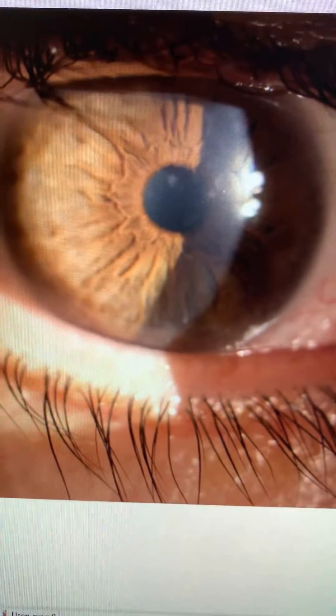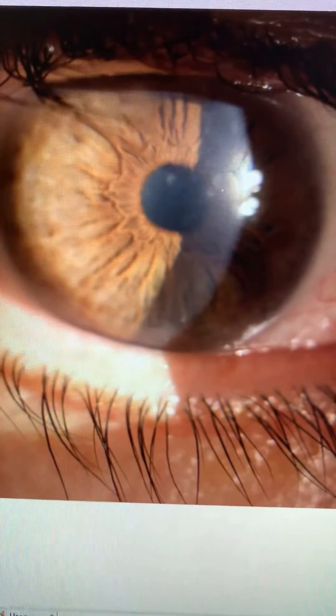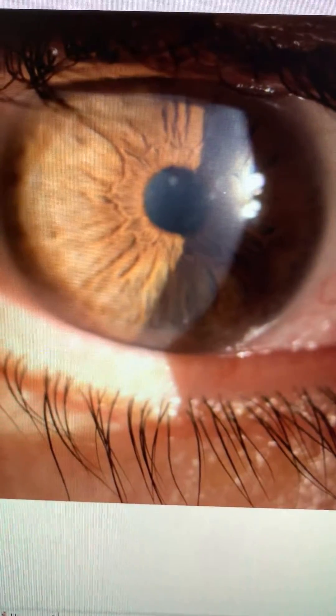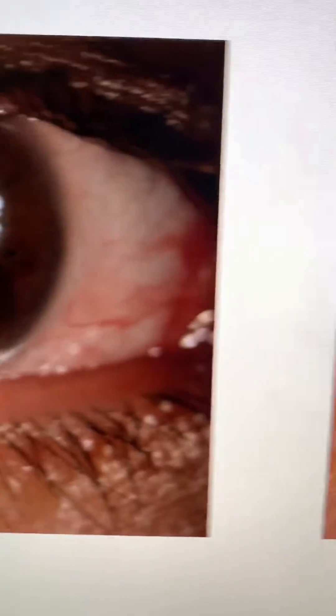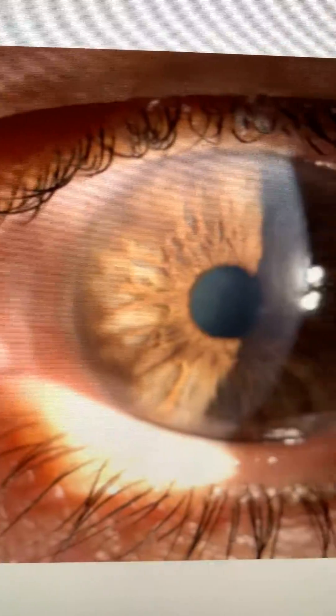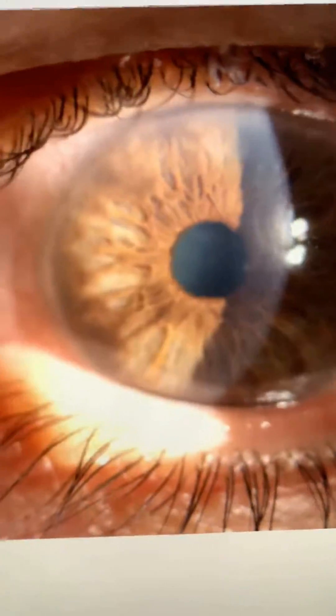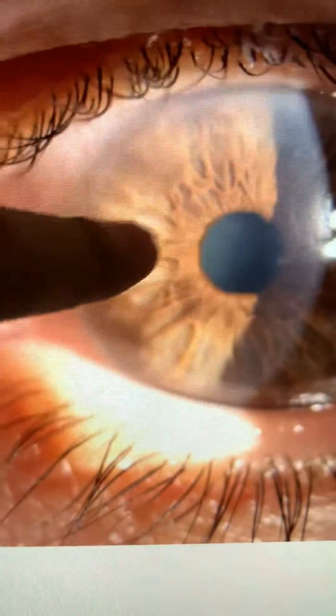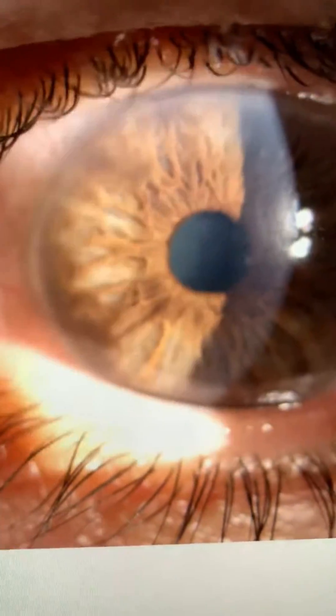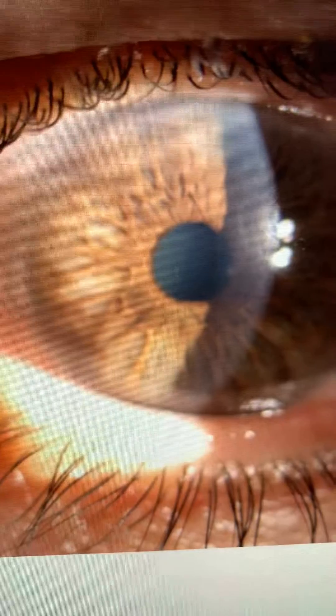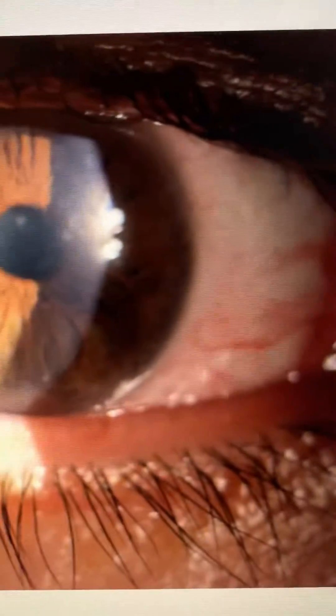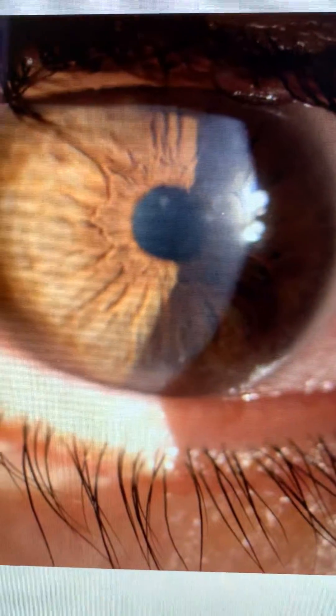These are the images today of a gentleman who has been suffering from EKC scarring. We can see some of the remnants. He's been six months on topical cyclosporin A, Restasis.